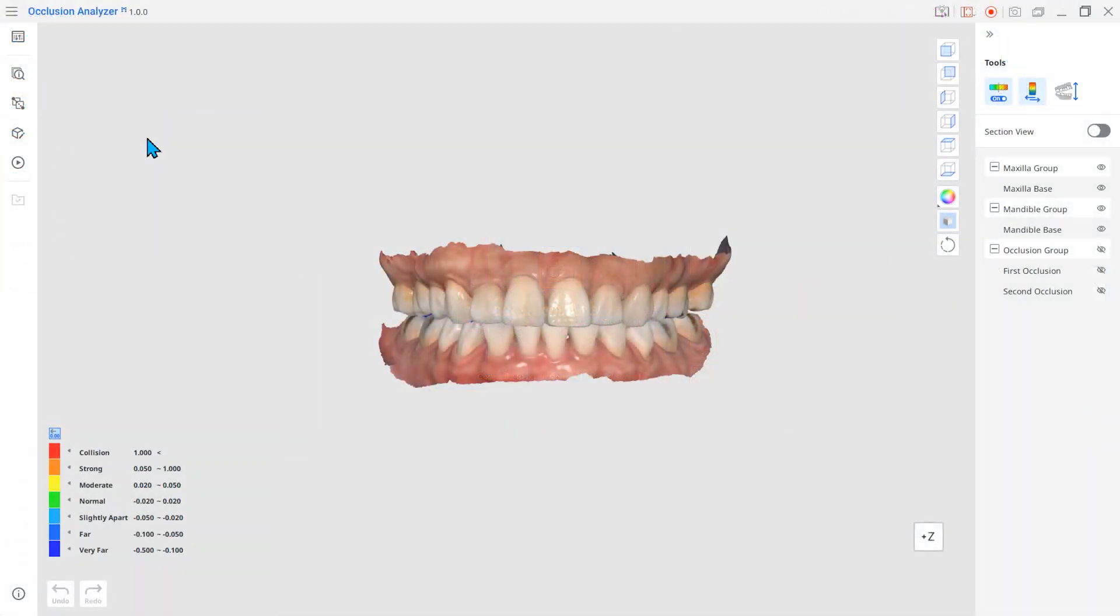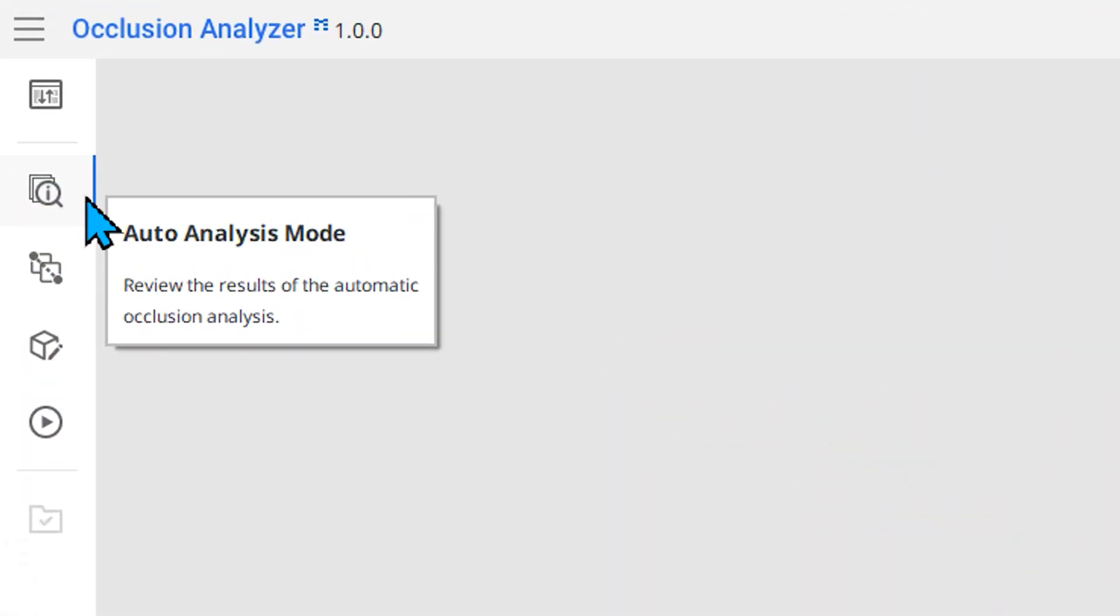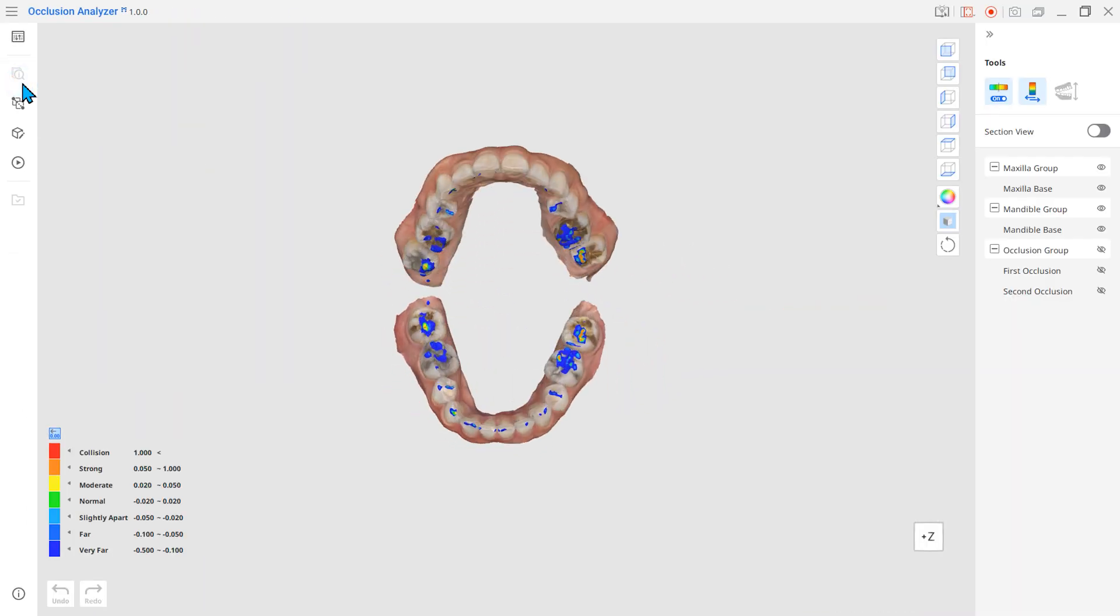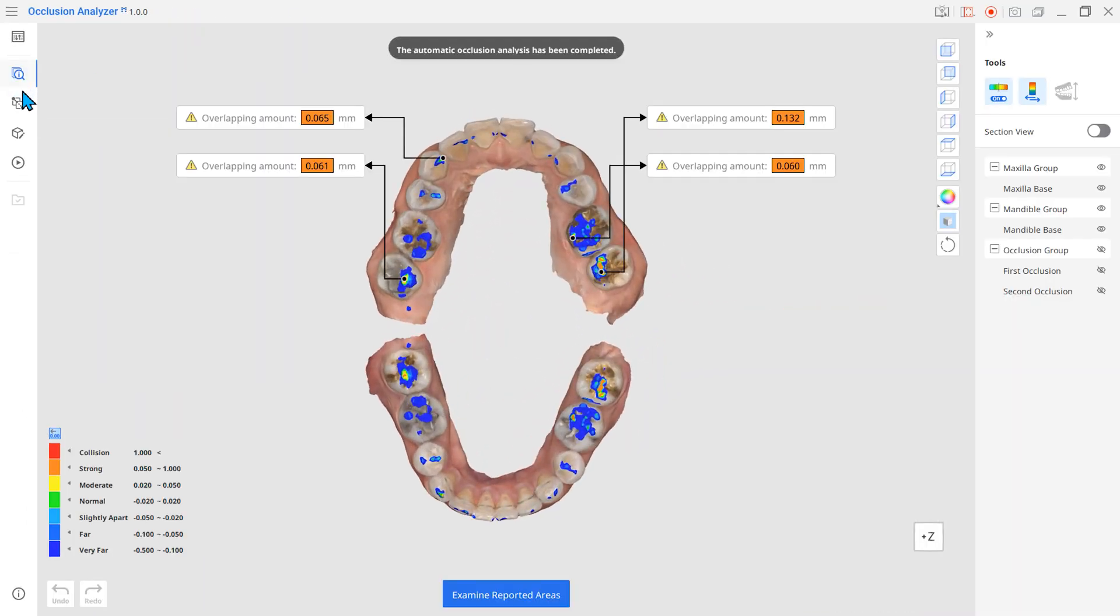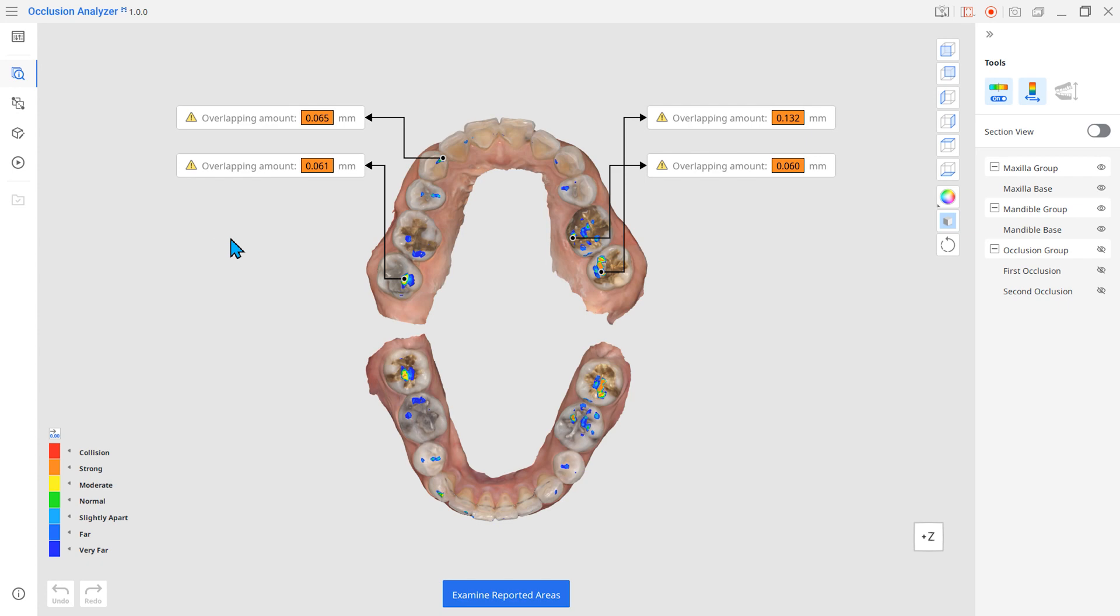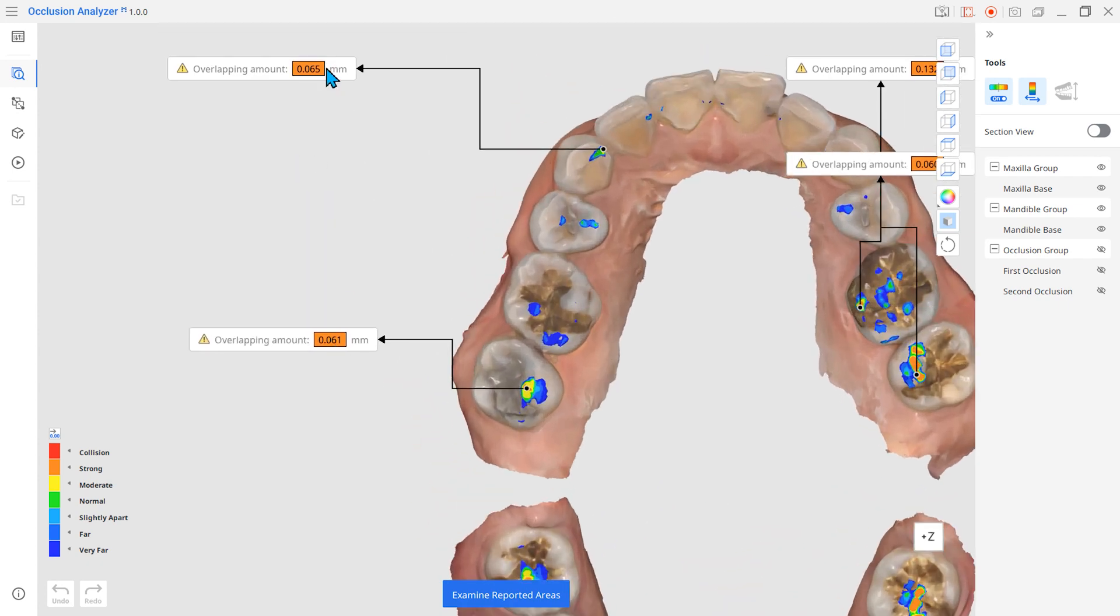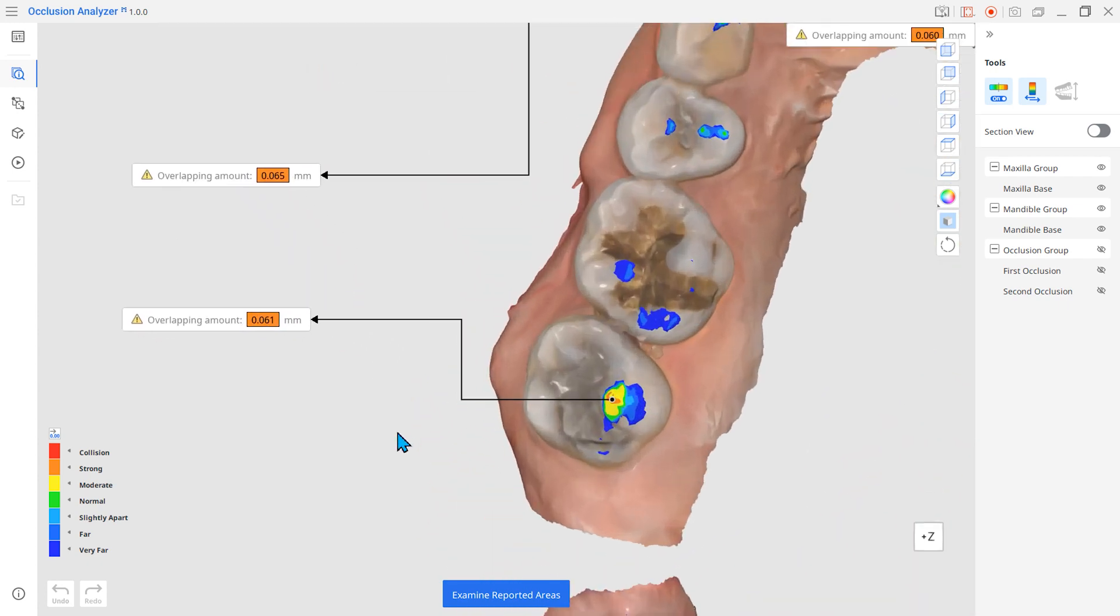Let's have a closer look at some of the key features. First off, we have the Auto Analysis mode where the occlusal interferences are automatically detected and reported through deviation values and color.